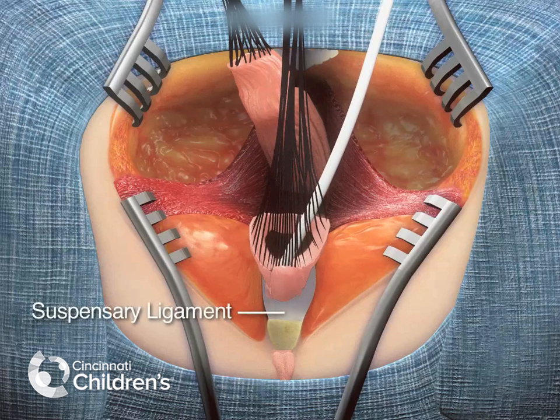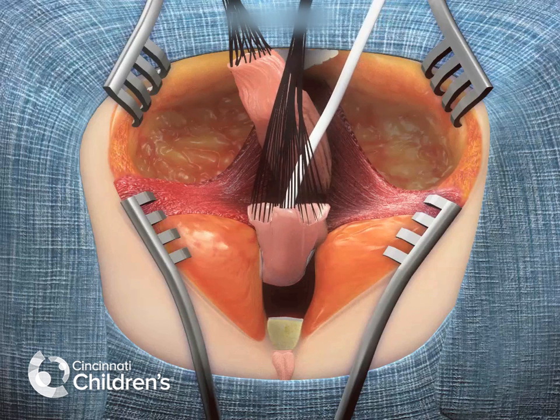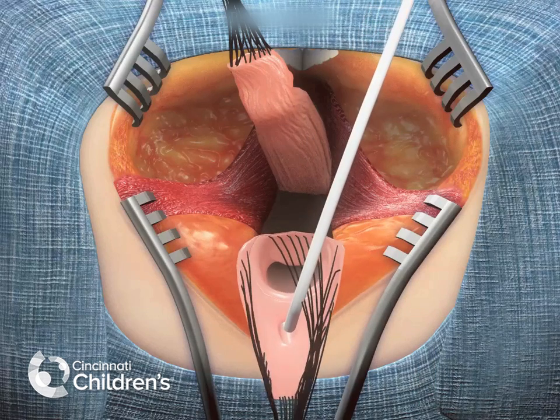At this point, the suspensory ligaments are exposed — an avascular plane that can also be dissected — and division of these suspensory ligaments often allows these structures to be moved towards the perineum between 2 and 3 cm.